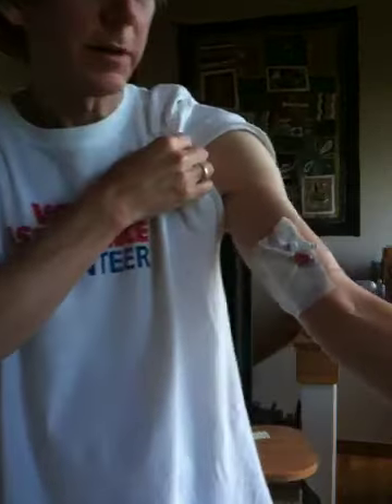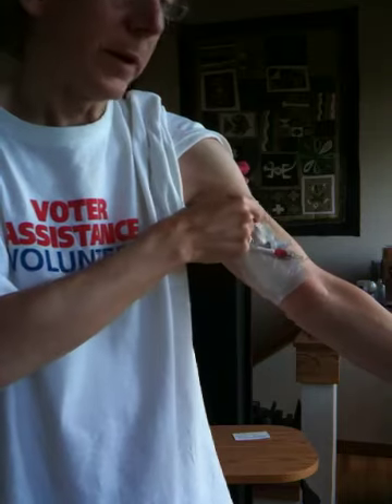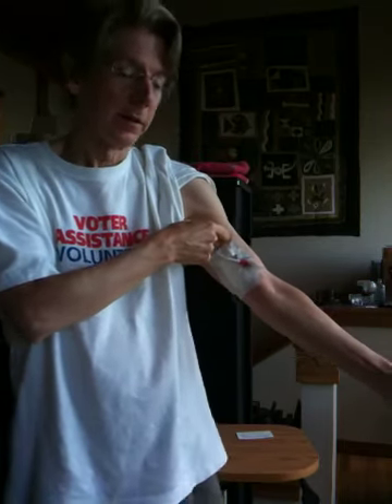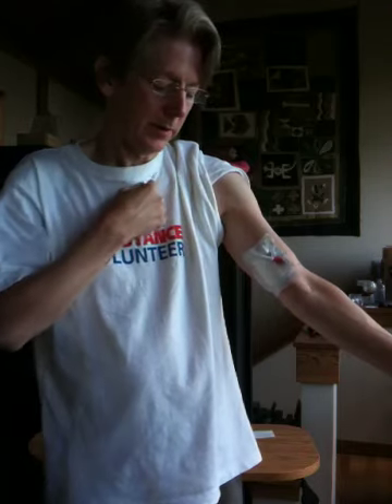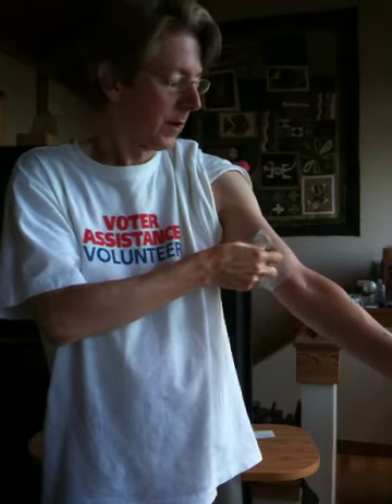Here I am with my IV — I've had it in for six months. You can see it goes into my arm and into my superior vena cava, all the way up into where my heart is, just above my heart.